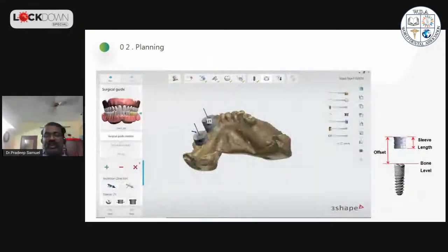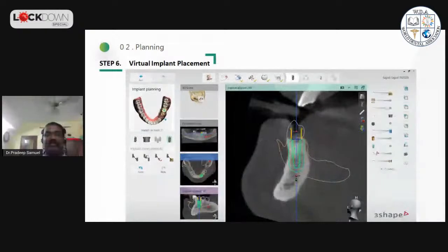So this gives you an excellent view, because when we are doing surgery on the surgical table, there are no surprises on the table. We know what the structures are, how far we are from the structures, and what the distance is between the cortex.